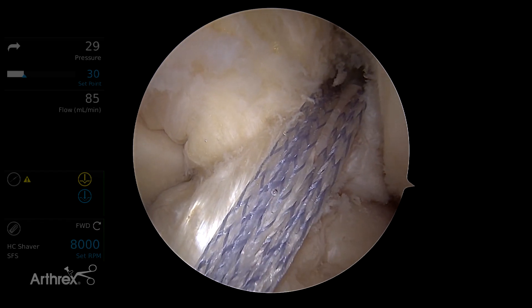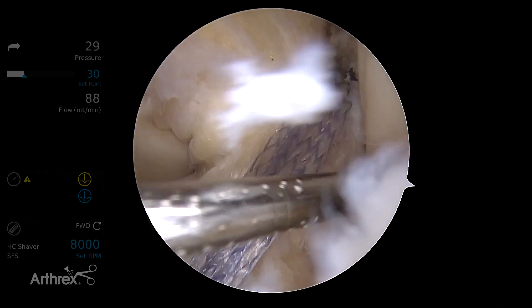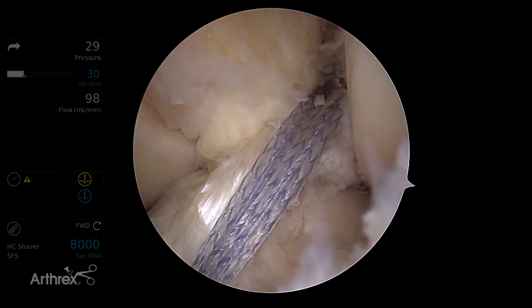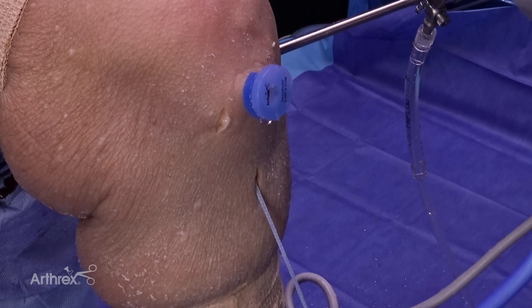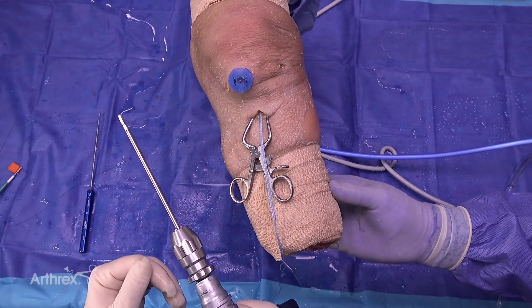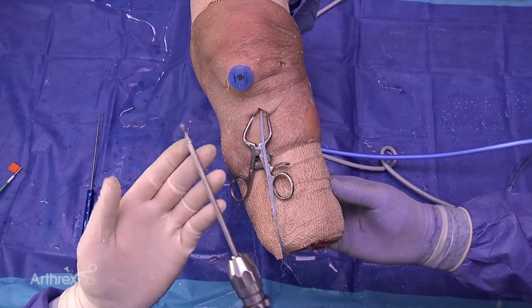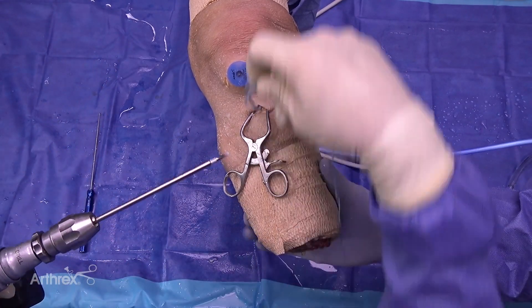There you have an internally braced primary ACL repair using the swivel lock ACL repair kit. You can seat these fiber tapes as you like. The ACL is nicely tensioned against the wall and we've got the fiber tape to back up fixate it. Now we're going to put our last swivel lock down in the tibia to anchor our fiber tape. We're going to tension that fiber tape with the knee in full extension. If the bone isn't too hard, you can use the 2.4 drill pin. Here we have the reusable spade tip for hard bone to drill a slightly bigger hole — we'll use that for demonstration purposes.